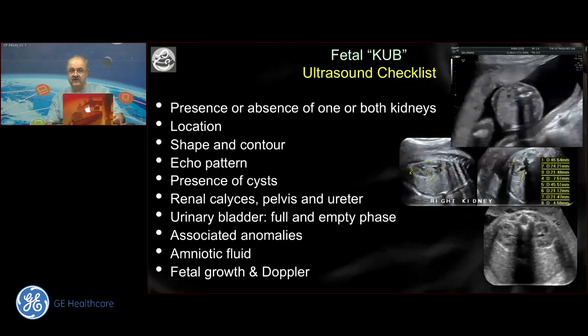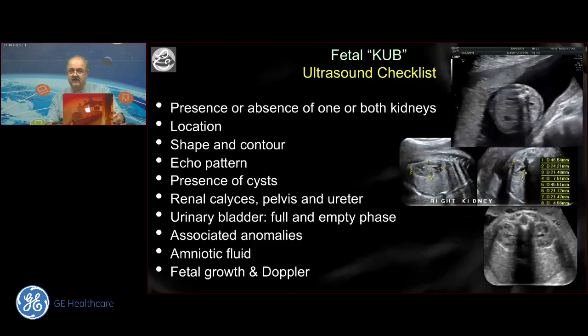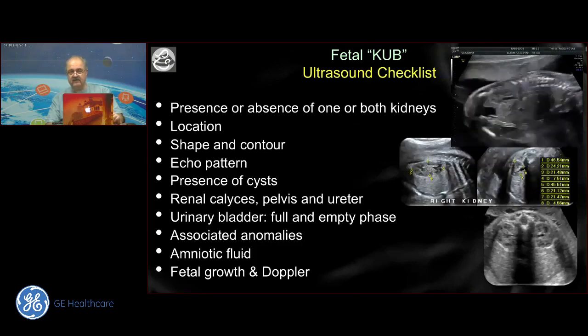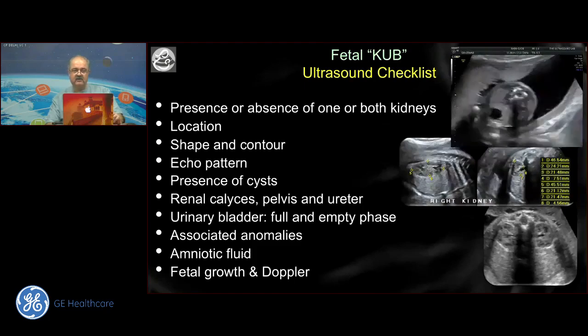You could have an acute renal shutdown and plenty of amniotic fluid. You could also have poorly functioning kidneys with poor specific gravity urine and a normal amount of amniotic fluid. So we have realized over the years that amniotic fluid is not a true indicator of kidney function. We will discuss what the new indicators are.